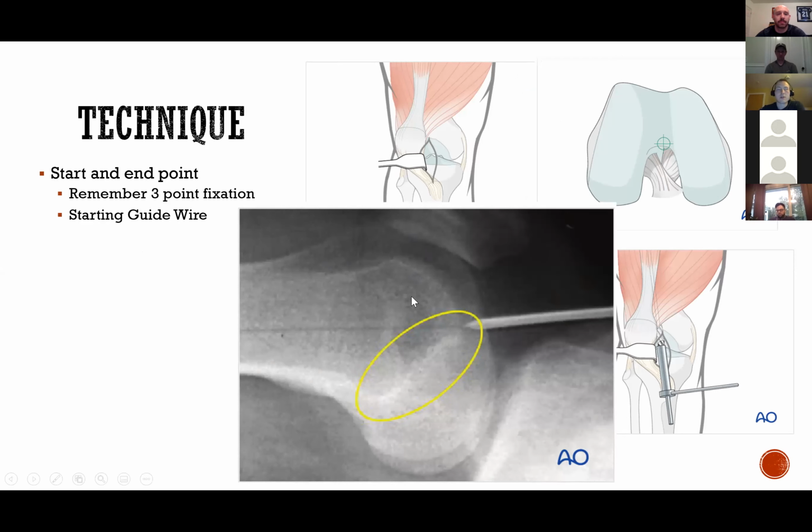I don't want to skip ahead and spoil anything, but there are well described parameters that you want to look at for each area of the body, trying to obtain a perfect x-ray. For a lot of the stuff that we're doing for nailing, we're always focused on the knee, and on getting perfect x-rays at the knee. The easiest and most consistent x-ray that you can get at the knee is a perfect lateral. A perfect lateral at the knee is one in which the posterior convexity of the femoral condyles should overlap. This is not a perfect lateral, but it is pretty close.